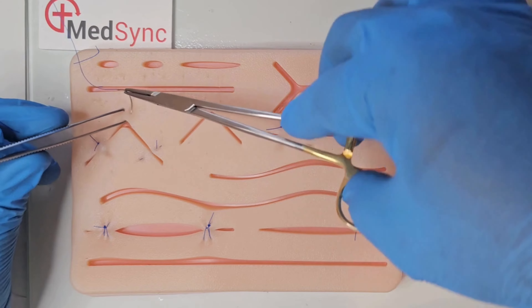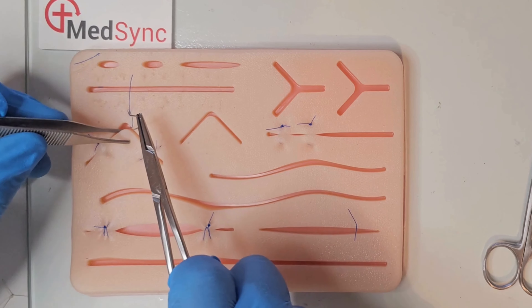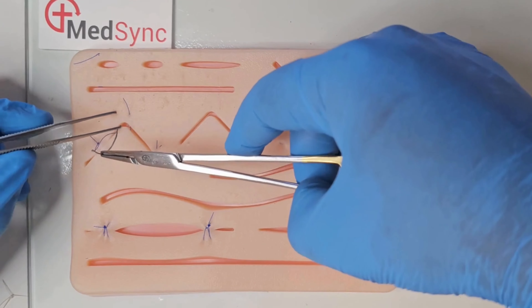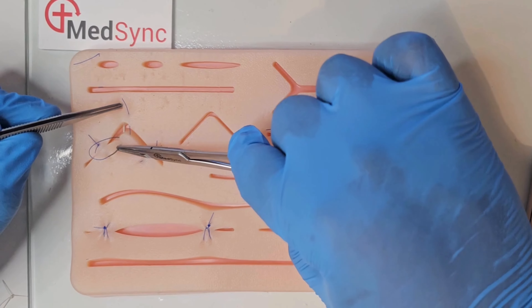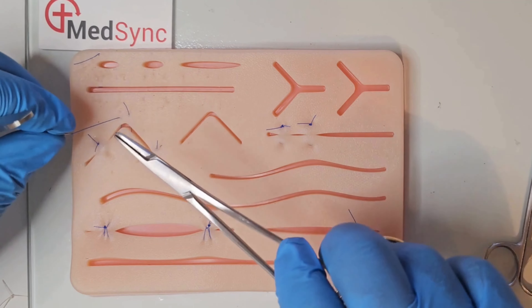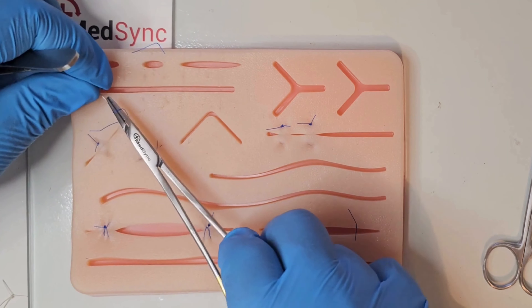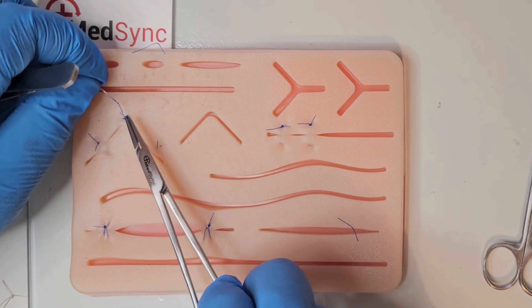The half-buried suture starts like an interrupted suture with an entry point. On the opposite side, however, you take a horizontal bite under the epidermis within the dermis — the suture should not be visible. You finish by going from inside to out, exiting adjacent to where you started, like the final bite of a mattress suture. Tie your knots to get approximation of dermis to dermis, epidermis to epidermis — your standard surgeon's knot followed by two reef knots.